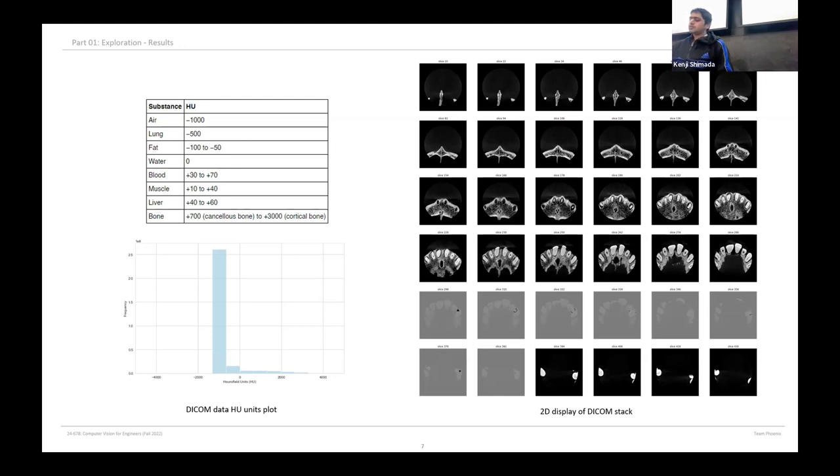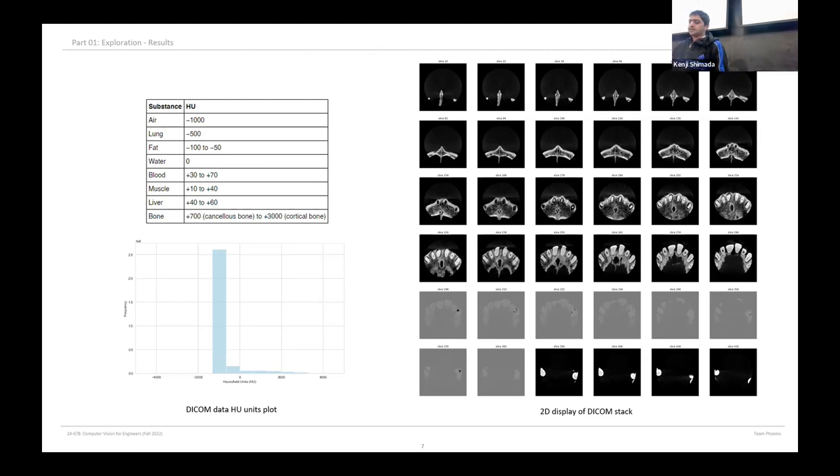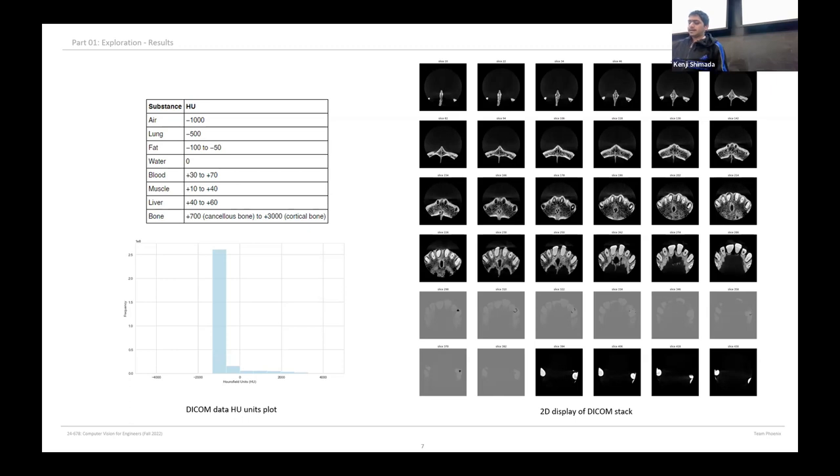Now you must be wondering what information does the table contain. As Lisa previously explained, it is the standardized unit of measurement of material medium in the DICOM stack, called the Hounsfield unit. This quantitative measurement is extremely helpful in determining the material medium within the dental cavity. For example, from our analysis we found that the majority of the material medium in our case is air, which is as expected.